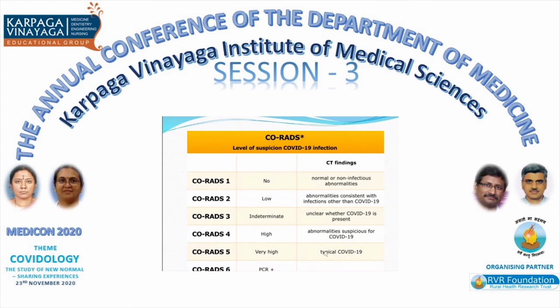So it's typical of COVID. Whereas CO-RADS 2 is a low probability, that is, abnormalities are consistent with infections other than COVID. If you have COP or other pneumonias, then it is CO-RADS 2. But CO-RADS 3 and CO-RADS 4 are the important ones, because the findings are indeterminate. They are unclear whether COVID is present or not. Again, CO-RADS 4 is a high probability.